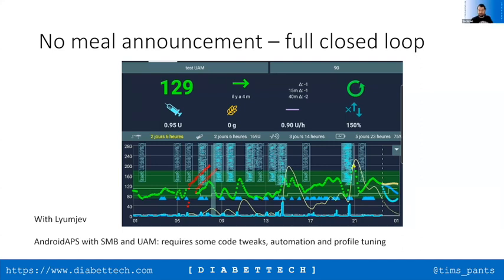That's fair enough. I either enter carbs or I do boluses. I don't tend to do all of it at the same time. And what I found with Lyumjev is, even with Lyumjev, there are some food types it's just not fast enough for. I also find that after a period of time using it, I have to revert back to a mix to calm it down a bit, because my glucose levels start to not be very predictable using it. But very different people have had very different responses to this. In some cases it works really well, as we've seen. In other cases it's not quite as perfect. Can't help that, but it's one of those things, unfortunately.